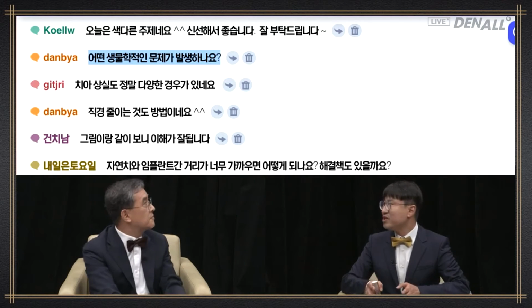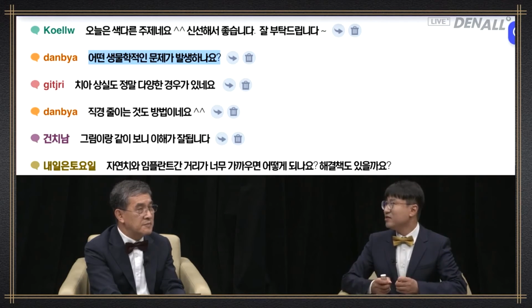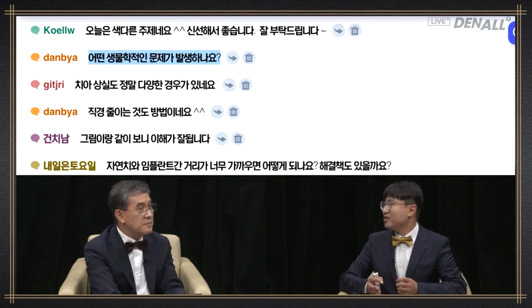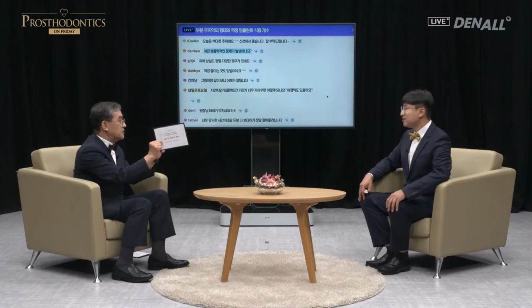If you can maintain and clean the embrasure, and in order to do that, you make the abutment really thin, it's not problematic. However, the problem is soft tissue sealing. If there is no soft tissue sealing, bone loss can occur and implant failure could occur as well. If you place it too close, cleansing becomes difficult, inflammation occurs.